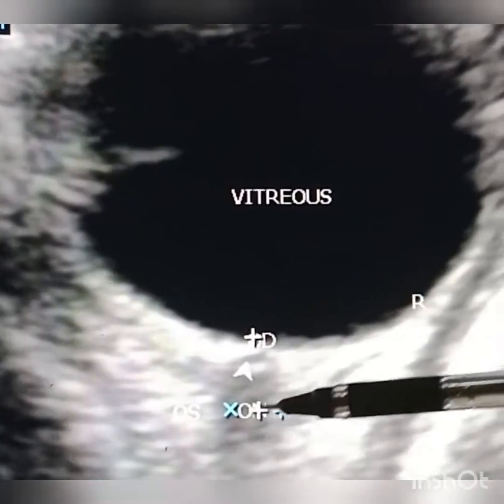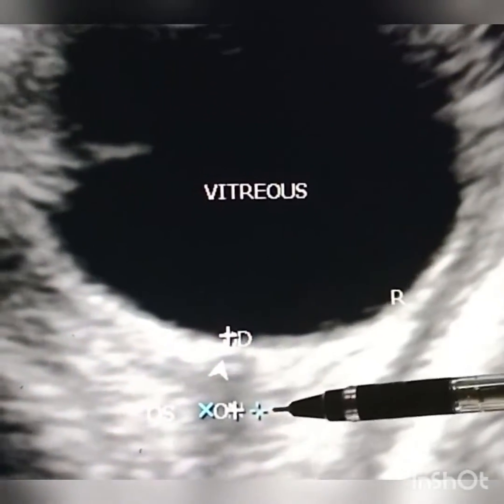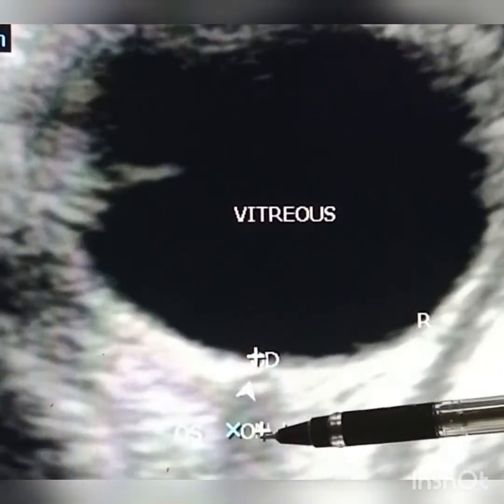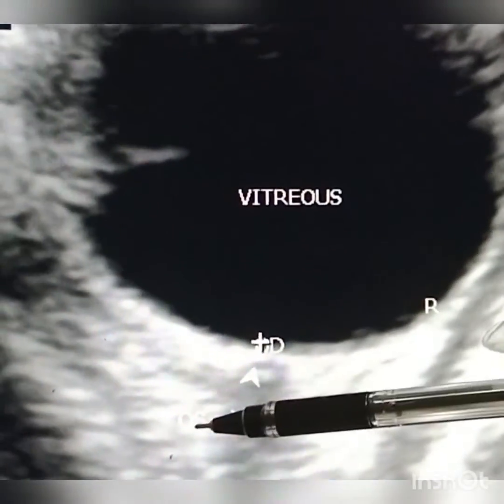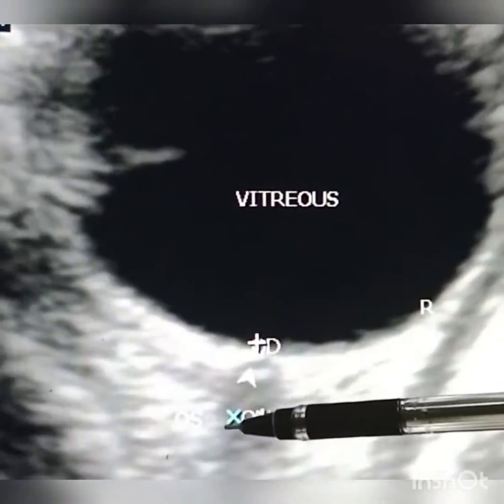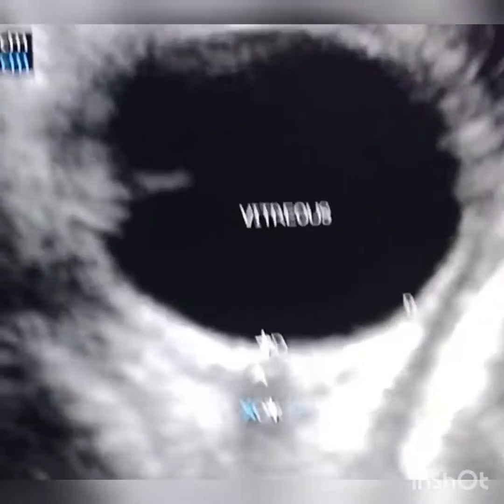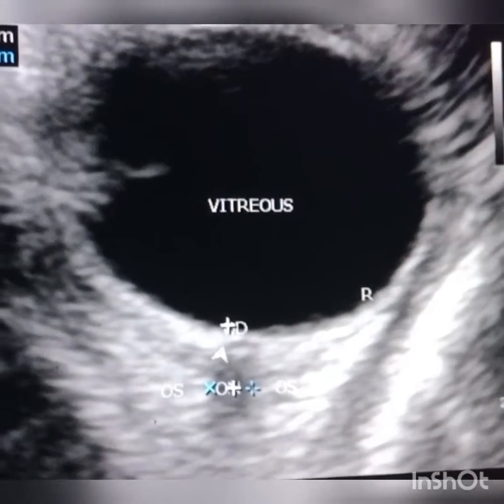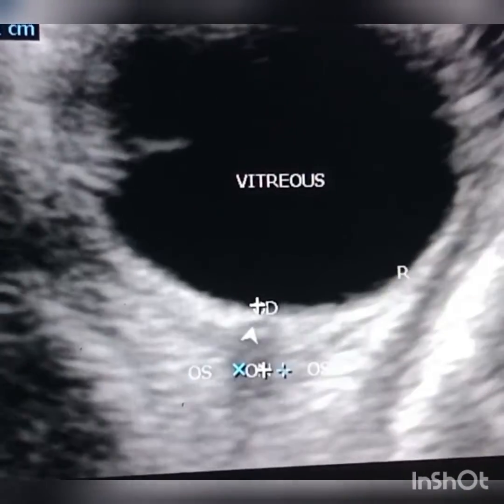At the level of 3 mm, I will measure the optic nerve sheath from here to here. So from the optic nerve disc, you go down 3 mm, and at that level you measure the optic nerve sheath diameter. This is very important — especially when there is increased intracranial pressure, the optic nerve sheath diameter increases.